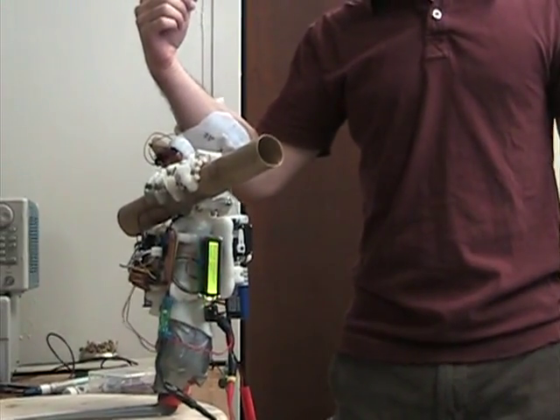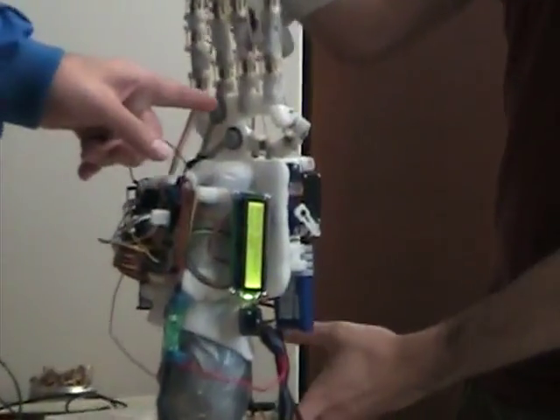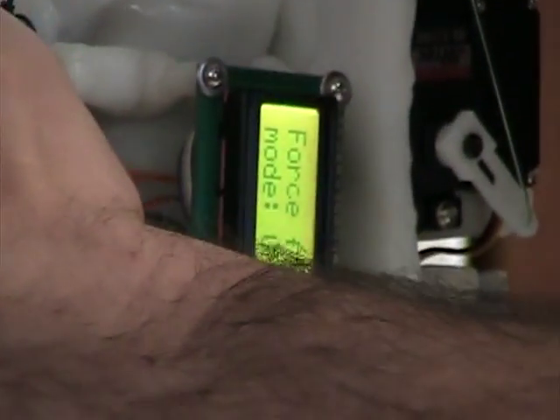Does anyone want to see anything in particular? Okay, open it up. Can we see the force feedback? Yeah. You can also touch it and see what happens. Stick your hand in and see.